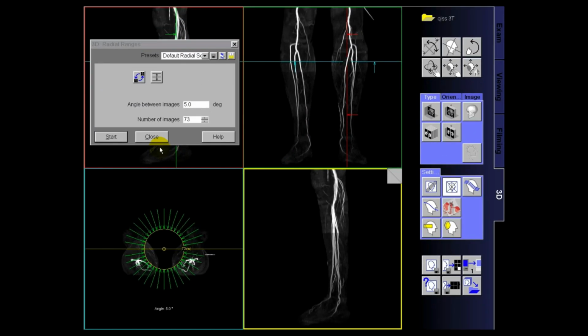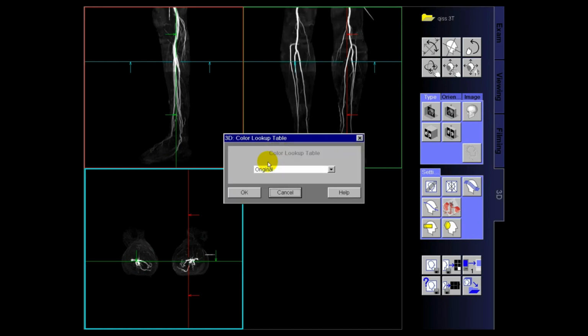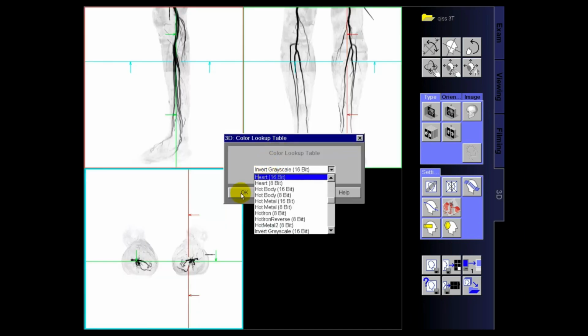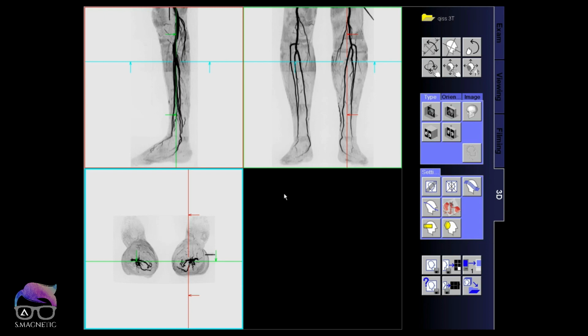Or you have option 2, you can just push this button. It will automatically send directly to PACS, and it will give a random name from the scanner. Or you can do invert of it if you want to. Well, that's it, guys. We finished 5 steps, and this is how the image can look like.